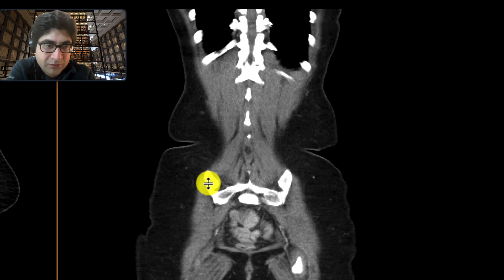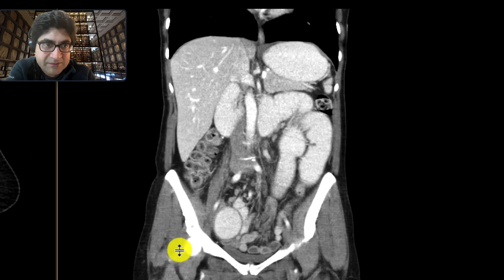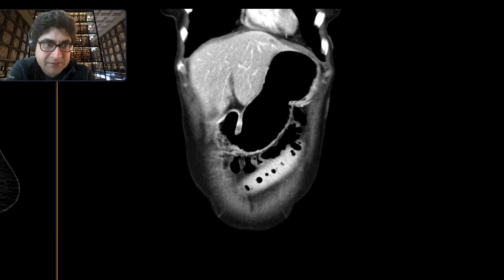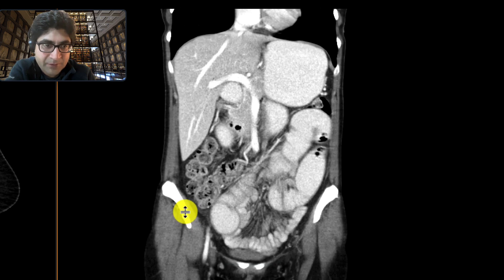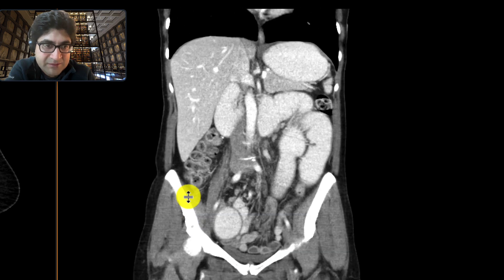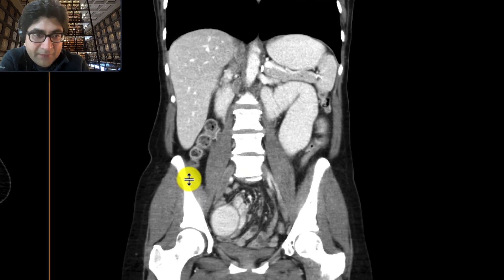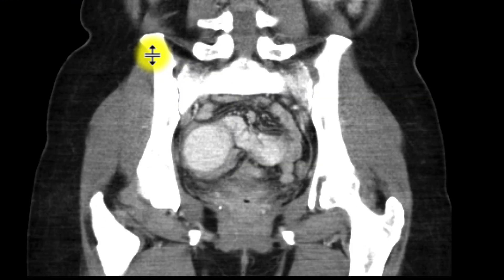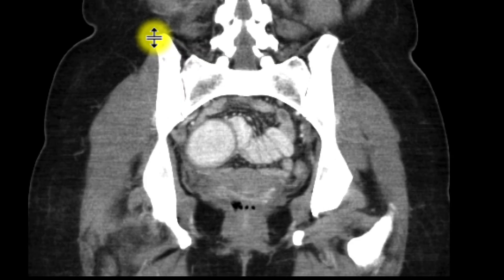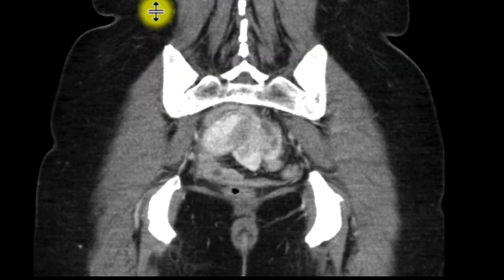If we look at the coronal images as well, we can see that there's a distended stomach, multiple distended loops of small bowel, and some underdistended loops of bowel more distally. Right at that transition, rather than it being adhesions — which is the most common cause of small bowel obstruction — or a hernia, which is another common cause, in this case there's actually a mass in that location.